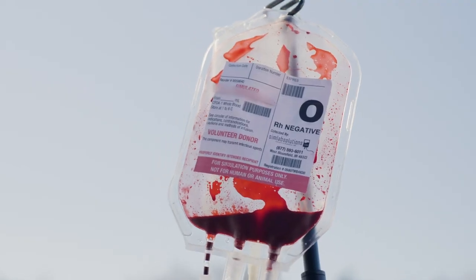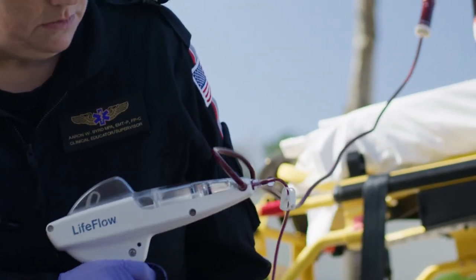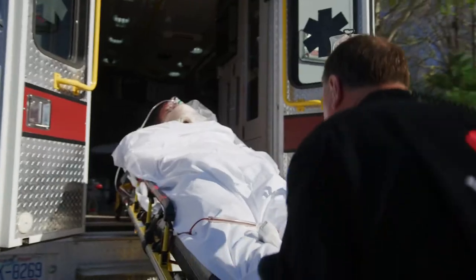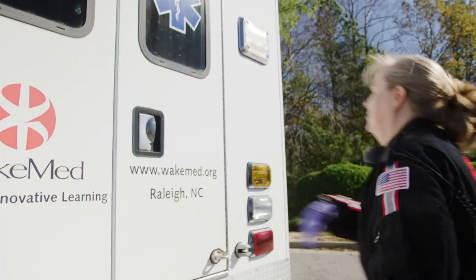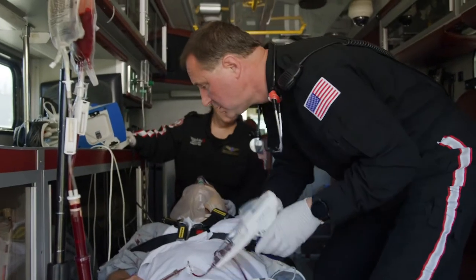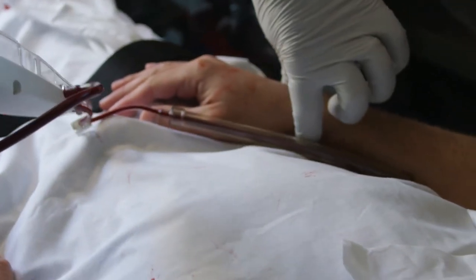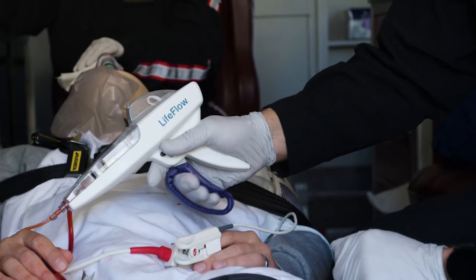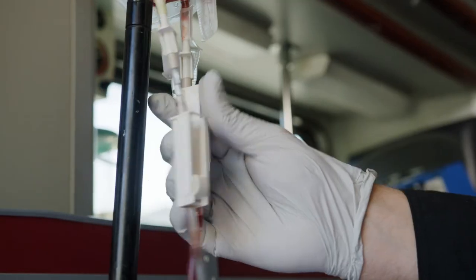You can deliver one unit of whole blood in two minutes with LifeFlow Plus. Note that one hand remains free to monitor the infusion site, assess patient response to treatment, and perform other tasks. Stop infusing while a small amount of blood remains in the bag.